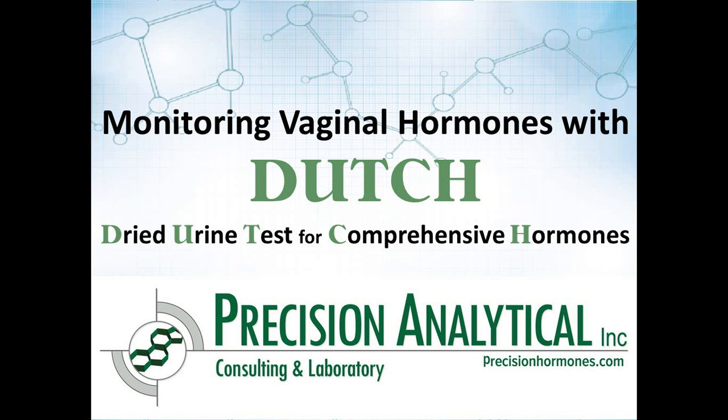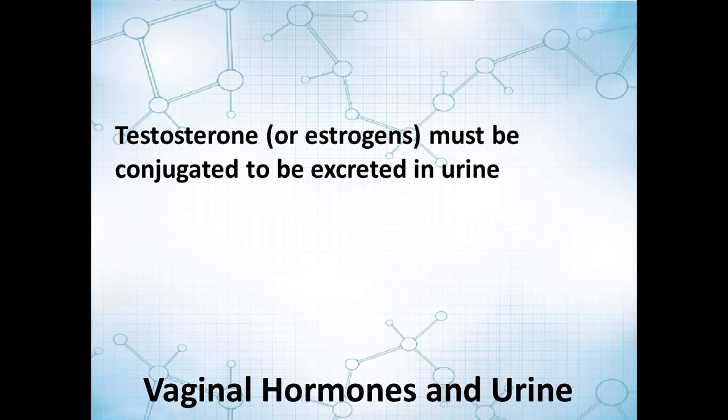This is a tutorial to assist with your interpretation of patient results with our dried urine test for comprehensive hormones when the patient is using vaginal hormones. Just as a very quick reminder, in urine we don't find hormones in their free form except for cortisol.